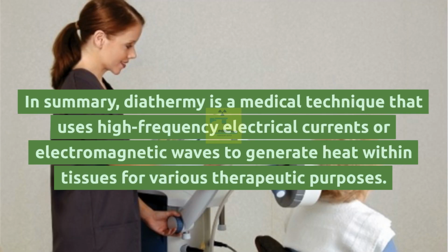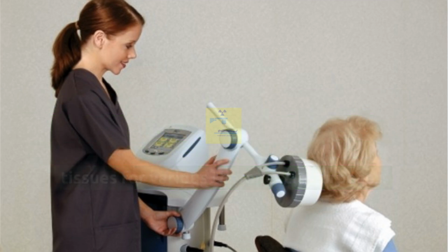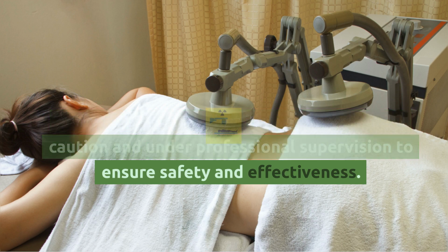In summary, diathermy is a medical technique that uses high-frequency electrical currents or electromagnetic waves to generate heat within tissues for various therapeutic purposes. It has applications in surgery, physical therapy, and wound healing, but it must be used with caution and under professional supervision to ensure safety and effectiveness.